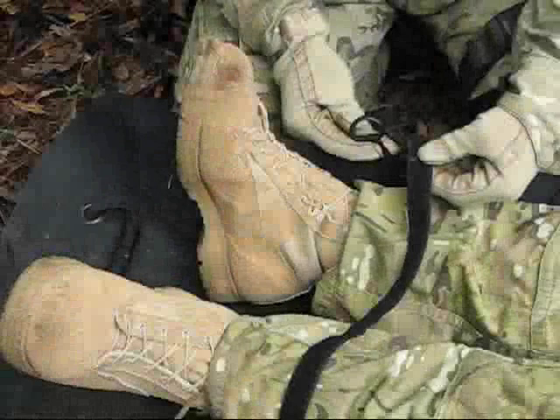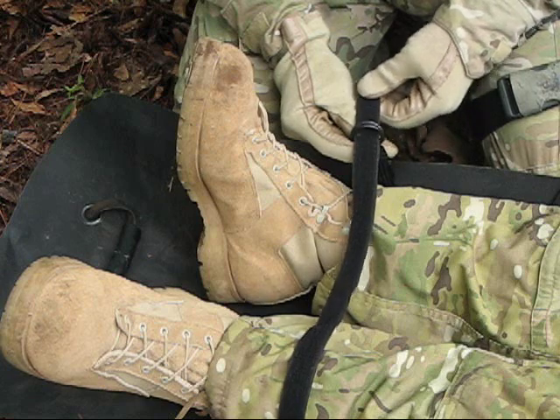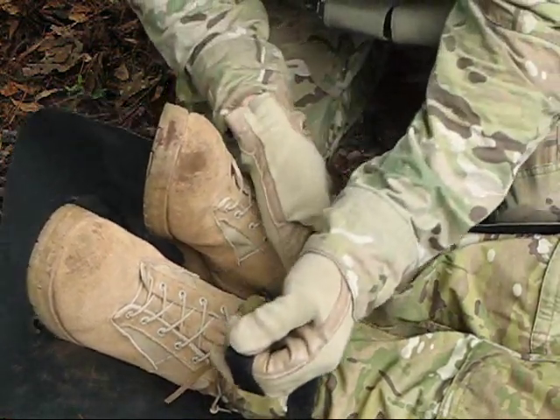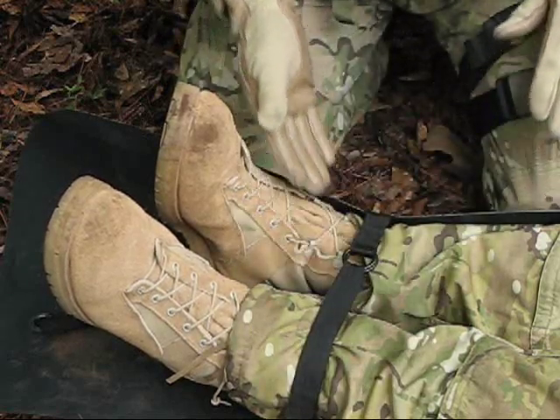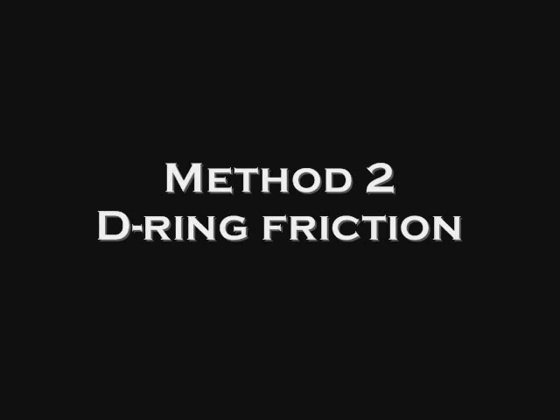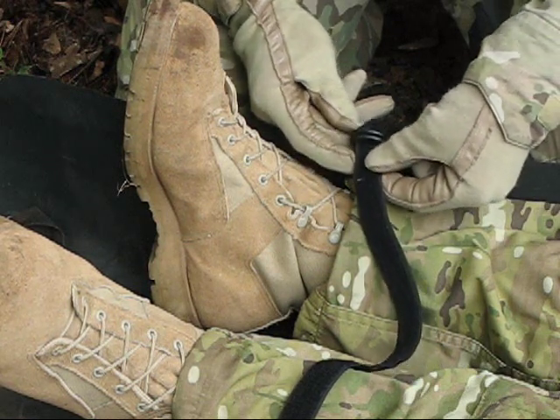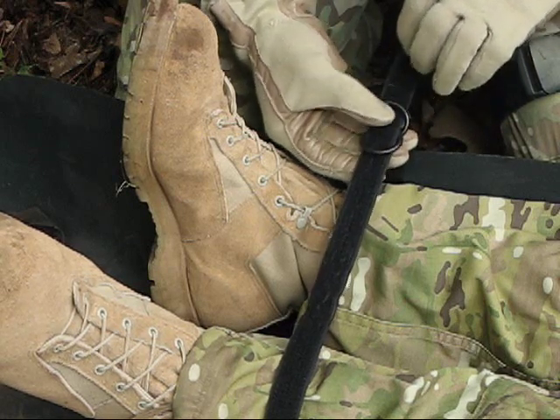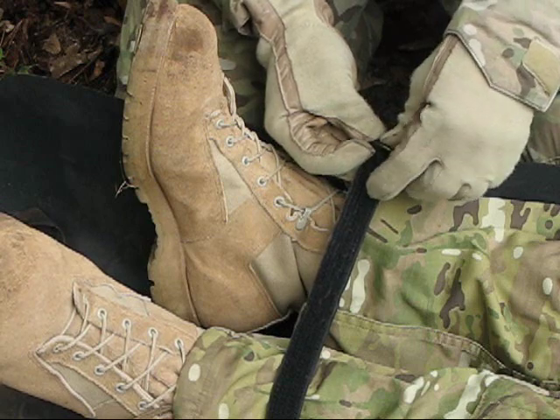Methods for securing the litter straps. To utilize method one, route the webbing through both D-rings. Fold the strap back on itself and press the straps together to secure the patient. Method two is recommended if you will be lowering a casualty down a stairwell or down steep terrain. Method two requires you to route the straps back through one of the D-rings. The friction created by the D-rings will secure the patient.